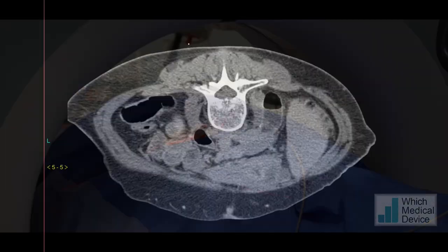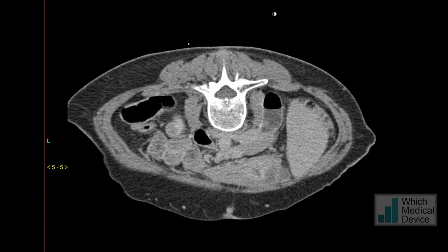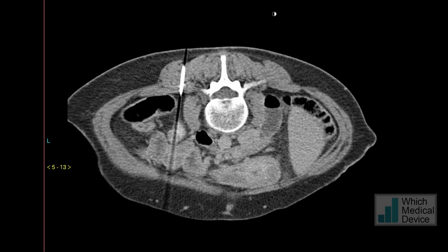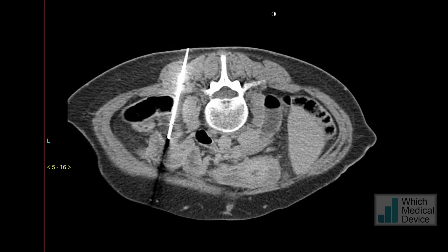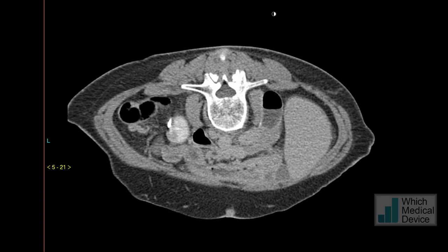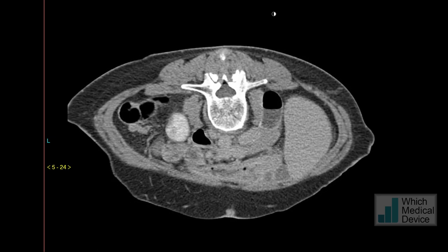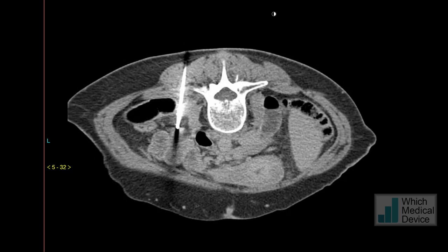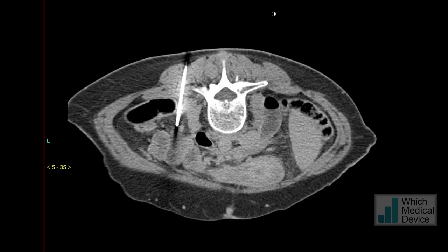As you can see on this short video showing the fluoroscopic steps, the needle is first placed superficially, then advanced through the muscle and fat. We have quite a narrow window to get it in. It's initially a little too lateral, so we reposition it more medially, and finally get it centrally within the small renal mass.